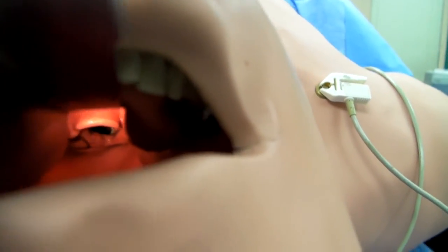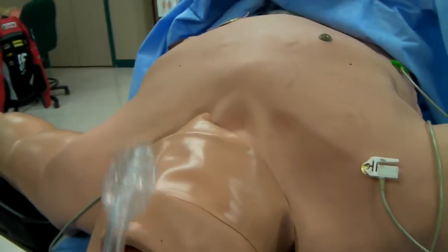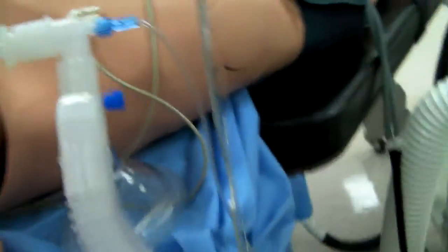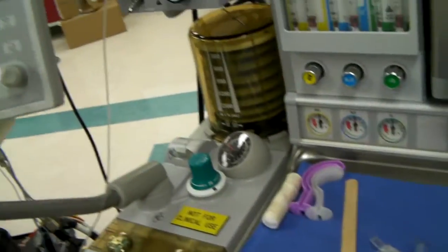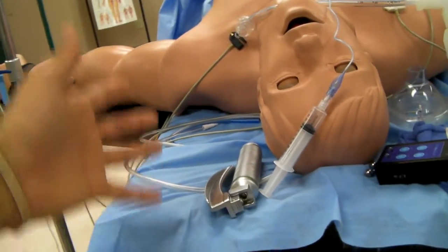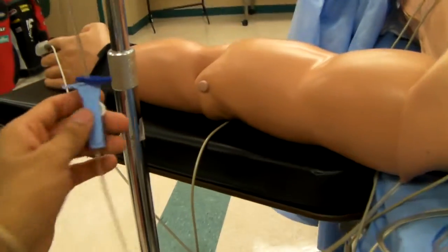But yeah, then this, which is an ET tube, goes through those vocal cords, and then you connect it to the circuit, and you breathe for him, and you put it on the vent, and all this other stuff, and then you monitor the patient intraoperatively. Right now I'm trying to get the motions and everything down. Let me turn off his fluids.